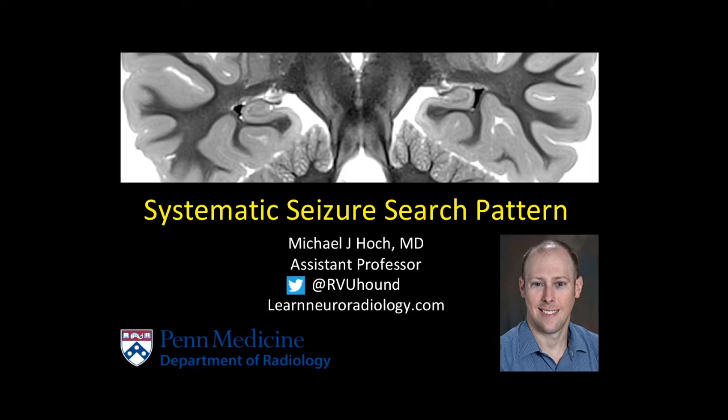Hello, this is Michael Hoch, and we're going to talk about seizure search patterns on MRI. As long as you have a pattern and stick to it, you'll be better for it. And today we're going to go over what my pattern is.